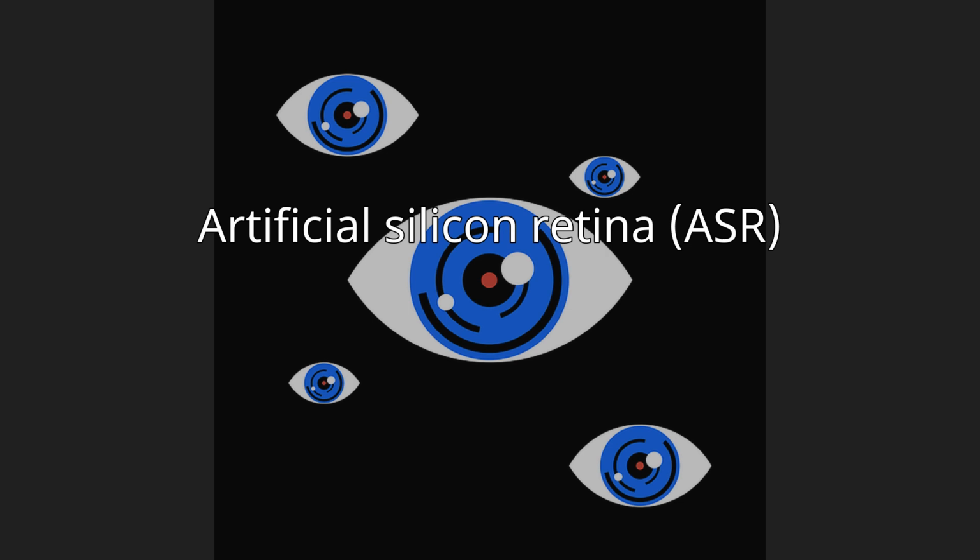Artificial silicon retina, ASR. The brothers Alan Chow and Vincent Chow developed a microchip in 2002 containing 3,500 photodiodes, which detect light and convert it into electrical impulses, which stimulate healthy retinal ganglion cells. The ASR requires no externally worn devices. The original Optobionics Corp. stopped operations, but Chow acquired the Optobionics name, the ASR implants, and plans to reorganize a new company under the same name. The ASR microchip is a 2 mm-diameter silicon chip, same concept as computer chips, containing approximately 5,000 microscopic solar cells called microphotodiodes that each have their own stimulating electrode.